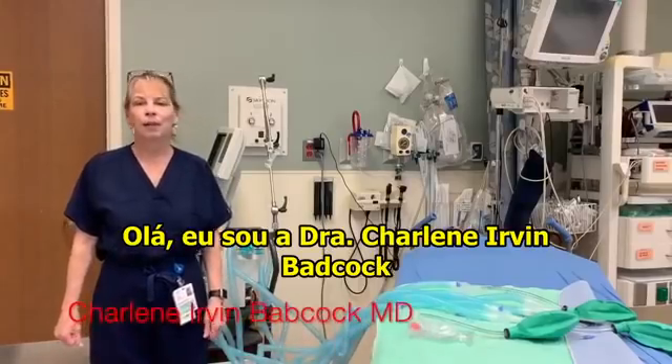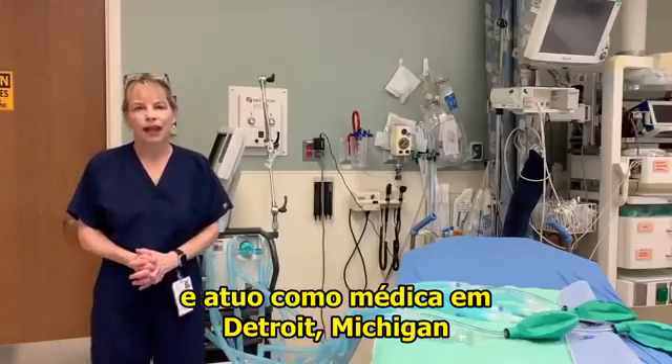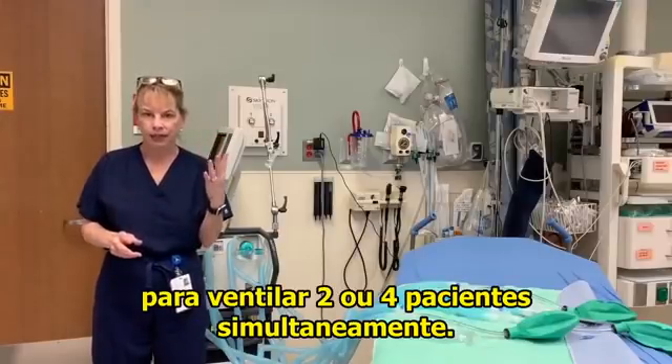Hi, my name is Dr. Charlene Irvin Babcock and I'm a practicing emergency medicine physician in Detroit, Michigan. On this YouTube, I'd like to show you how to modify one ventilator to ventilate two or four patients simultaneously.